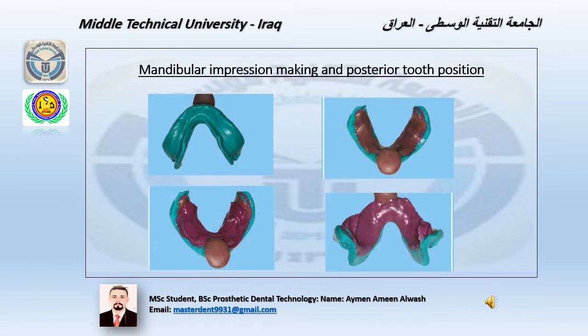In this type of technique we will use the outer surface as the key, and we will explain it through the presentation. The picture at the top left shows that we are doing the complete impression material, and in the picture at the top right, any excess or extension of impression material on the outer surface must be removed and adhesive material applied. In the picture at the bottom right of the slide, we add medium body vinyl polysiloxane impression material on the outer surface.